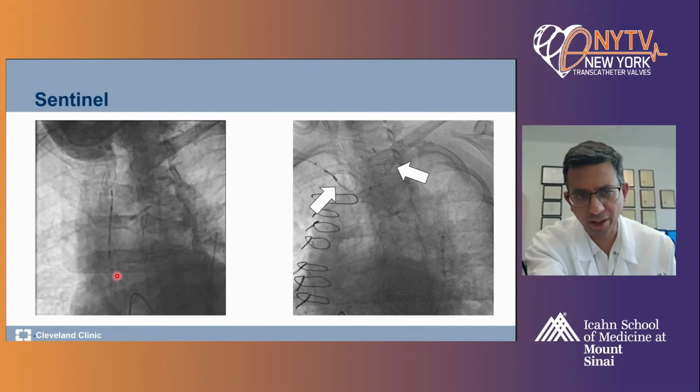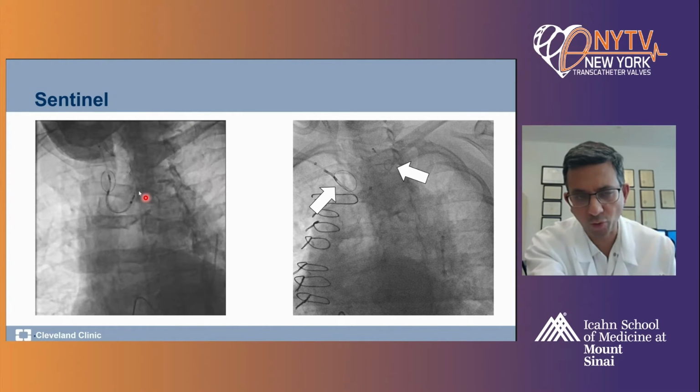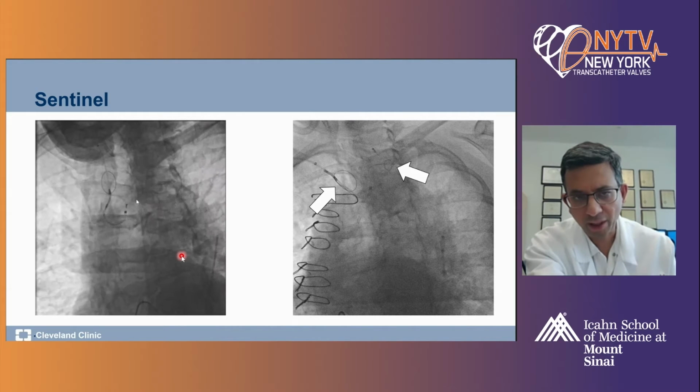So this is not a trimmed video. And we are flexing this catheter up and the carotid artery is somewhere there. So there is a small wire. Typically, I use the Whisper wire for most of the cases. And if you need more support, then a BHW wire. So it's a 014 wire, and it will go right there as the pointer points out. And as you can see, the wire is going up now. And now the next thing you will see is the distal filter going up.